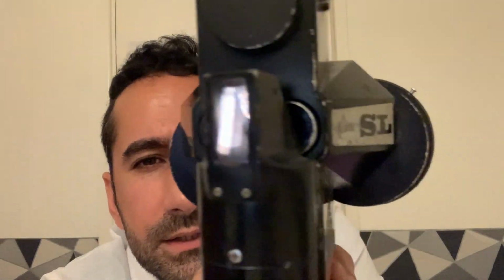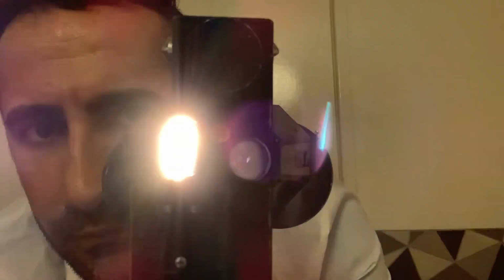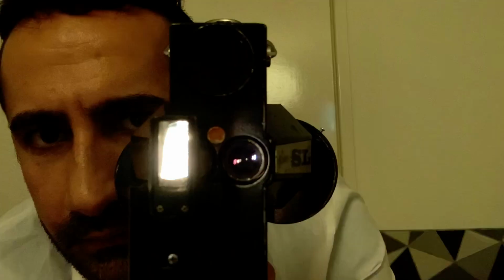I'm going to sweep across the eye, looking at the lids and the lashes. External look here, external look. The other eye now. Okay. Looking good.